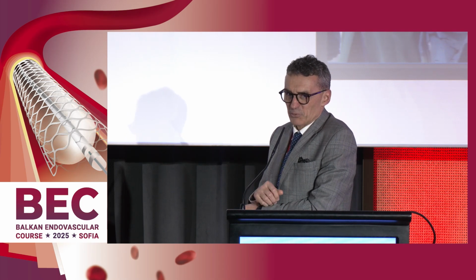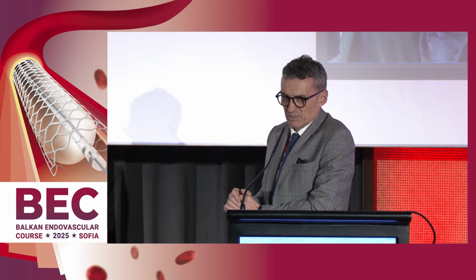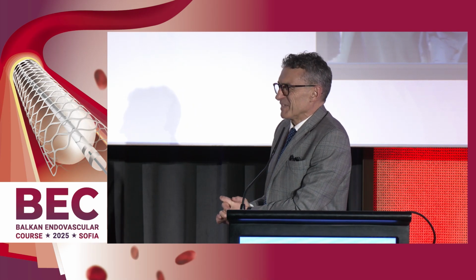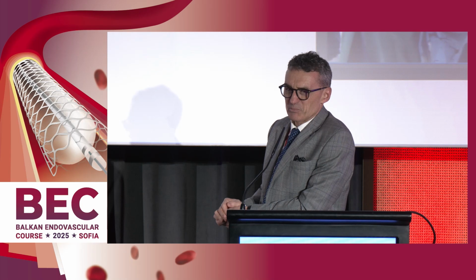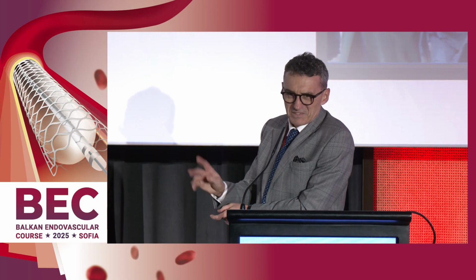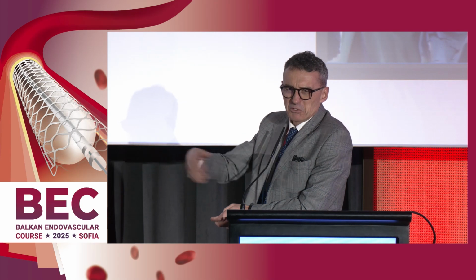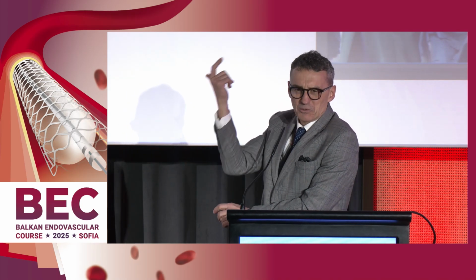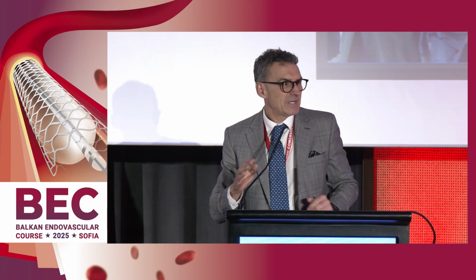The heart can forgive many stupidities, but the brain cannot. Sometimes we cardiologists put some air in the heart. In case you flush rapidly, it's gone in 2 minutes. The patient has some pain for several minutes and it's gone. But in the brain, it could be a disaster, absolutely.